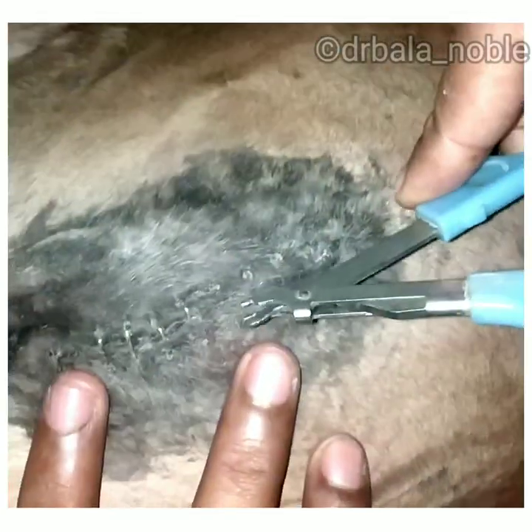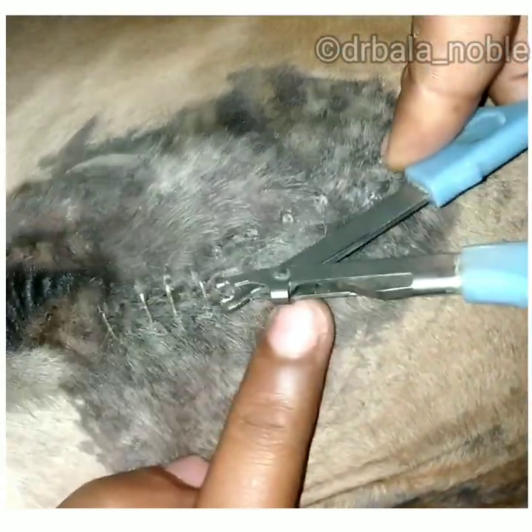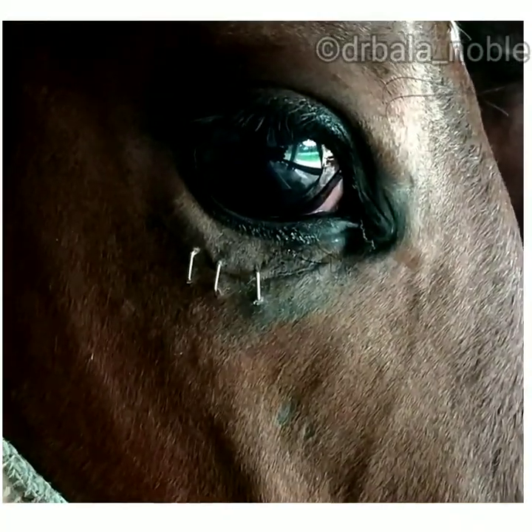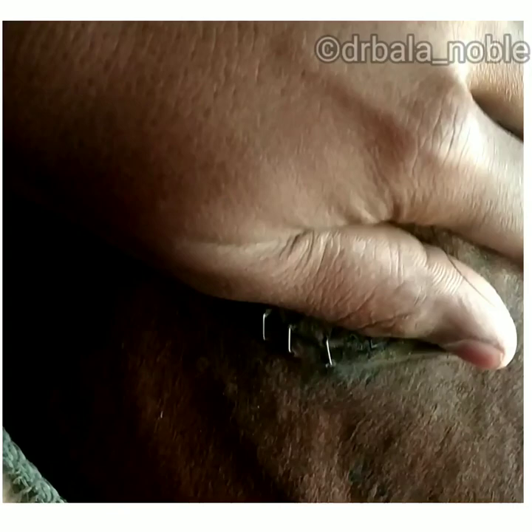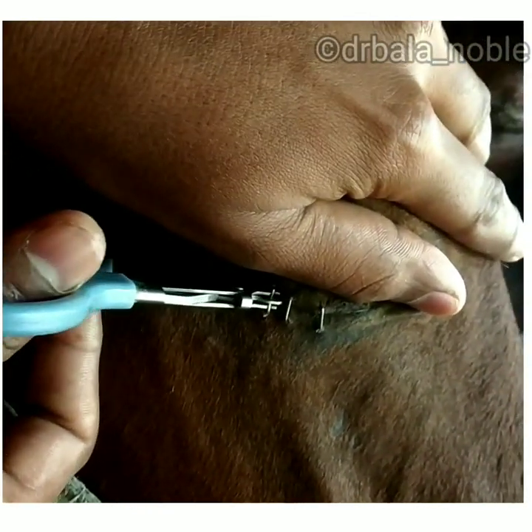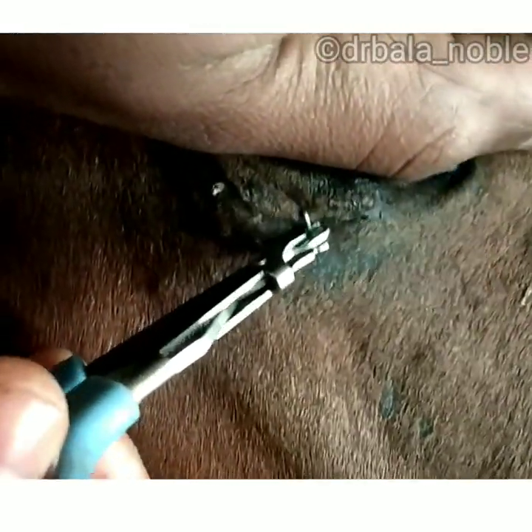Just insert under the pin and press it — it will come out. See that.